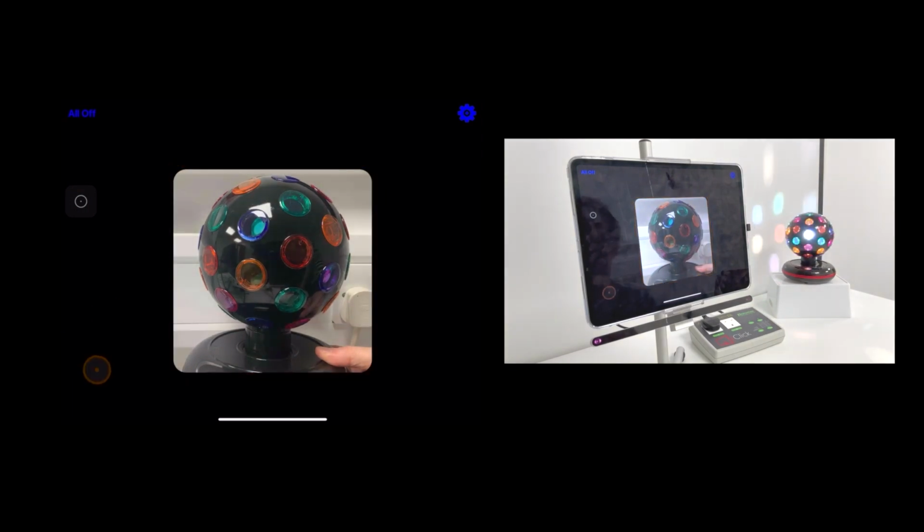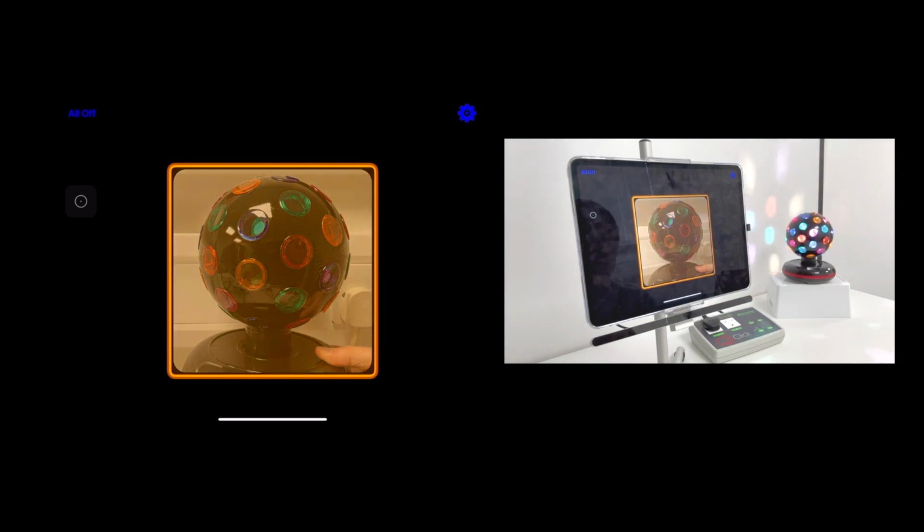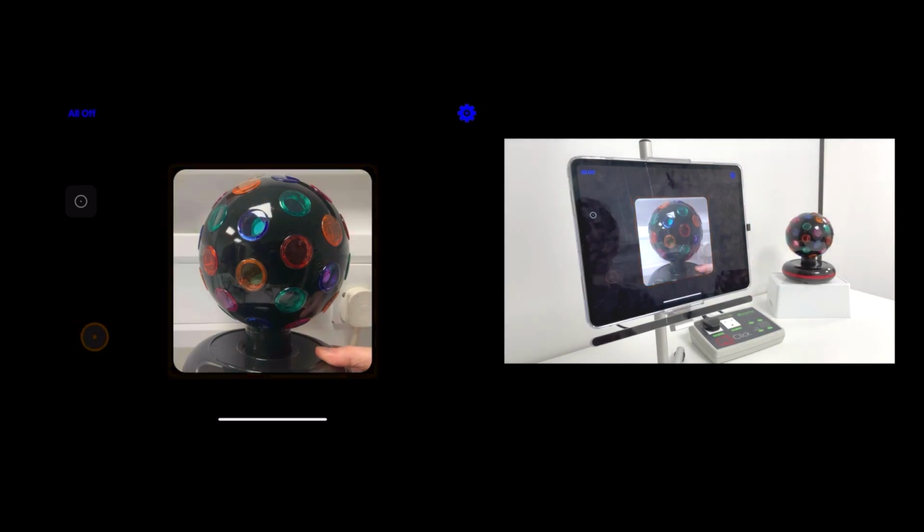Now I've got that set to latched mode, so that will keep on running until I look at it again to actually turn it off. So a lot of our schools that we support use things like this, whether it's disco balls or normal lights or food mixers, fans, electric fans. They use things like that as well, just to understand that nature of cause and effect of on-off devices.